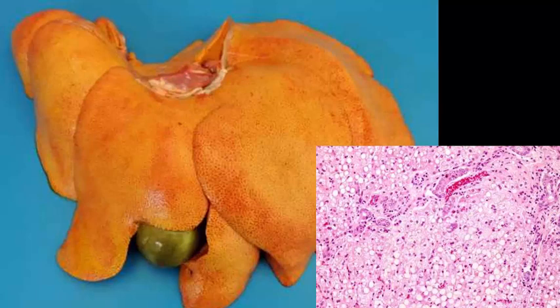Okay, and the last one, Depomedrol, which is a long-acting depot corticosteroid injection. That will give you a yellow liver. It doesn't cause a lot of necrosis. And what you see is glycogenosis, which is a different appearance than the single clear translucent fat globs in the hepatocytes. That's more of a spider cell appearance, and it's glycogen versus fat. There's always a little fat accumulation in severe corticosteroid hepatopathy because those hepatocytes are sick, but it's a glycogenosis change.